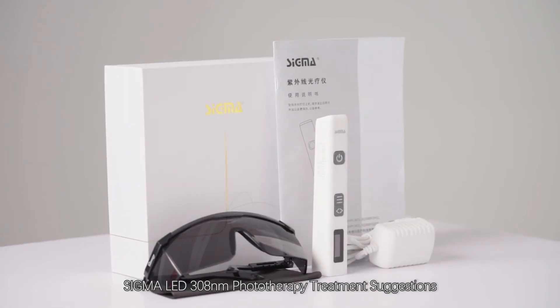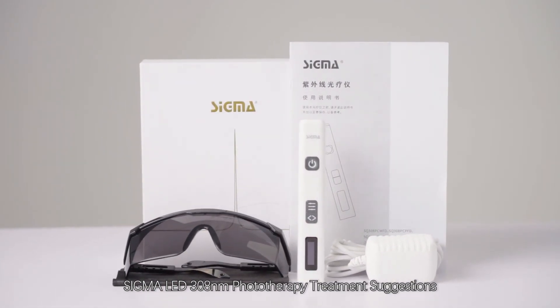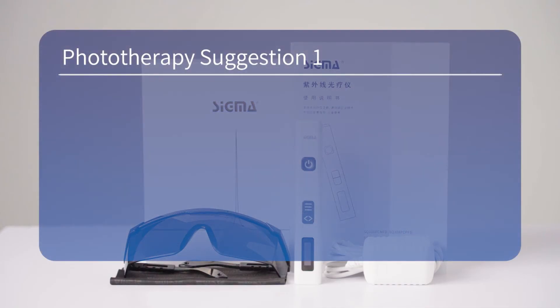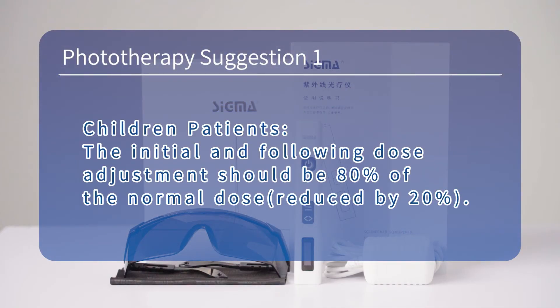Sigma LED 308nm phototherapy treatment suggestions. Phototherapy suggestion 1 — children patients: the initial and following dose adjustments should be 80% of the normal dose.